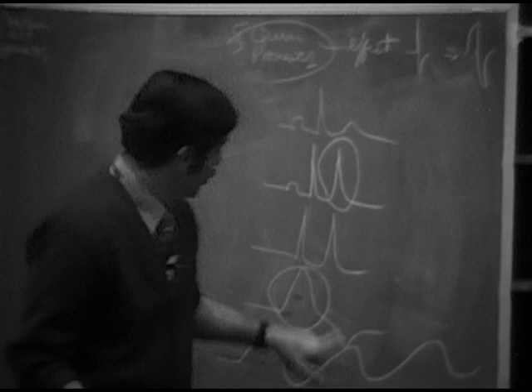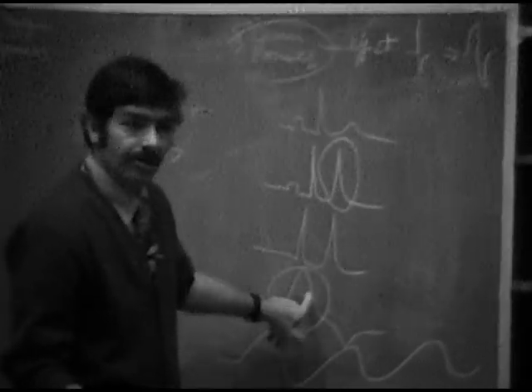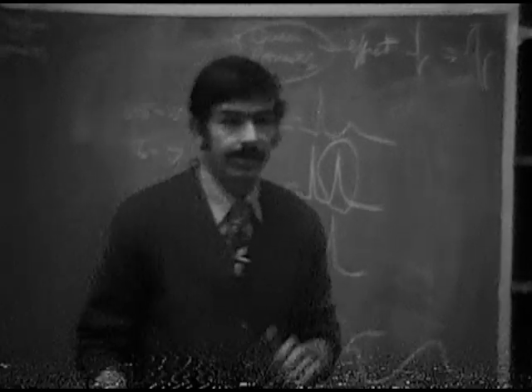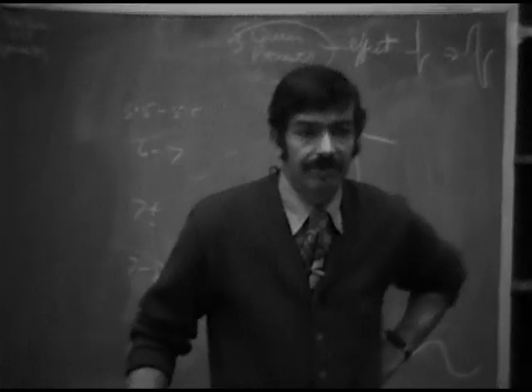That's the other differentiating point, is that in this type of situation, the rate is usually normal, whereas in complete heart block with idioventricular rhythm, the rate is usually fairly slow, 40, 50, or 30.